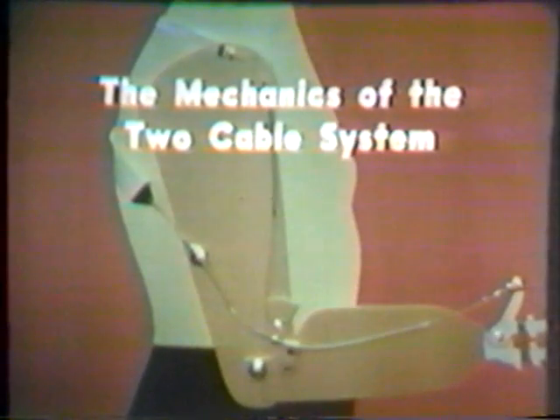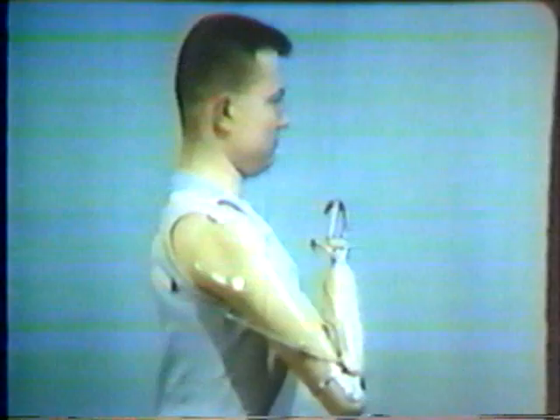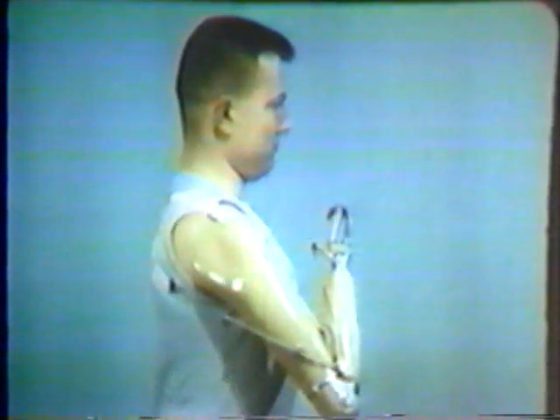First, the mechanics of the two-cable system. This system consists of two separately operated but functionally interdependent cables. One cable is used to both flex the prosthetic elbow and also to operate the terminal device. The second cable is used to lock and unlock the prosthetic elbow. This above-elbow amputee demonstrates the interdependent function of the two cables.